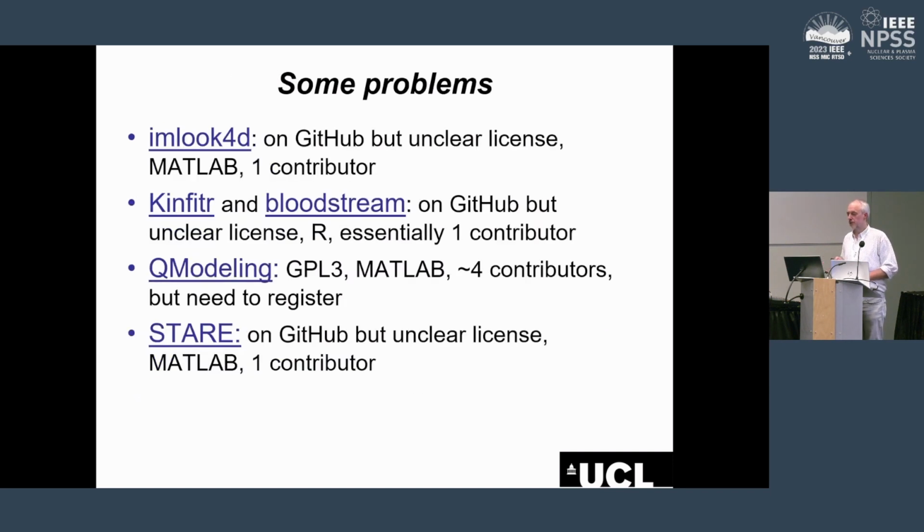Then I looked at some others which are very good packages as far as I know, and the papers are also very good, but you either see that there is one contributor, which feels a little bit scary because if that person retires, you're in trouble, or they haven't really stated what license they have, and that is a problem, because then you don't know what you can do with it.